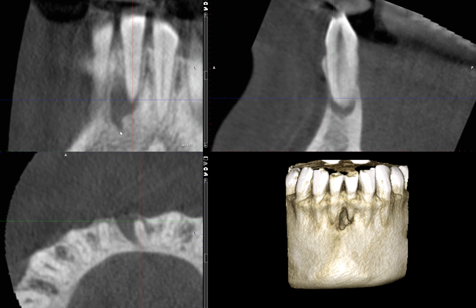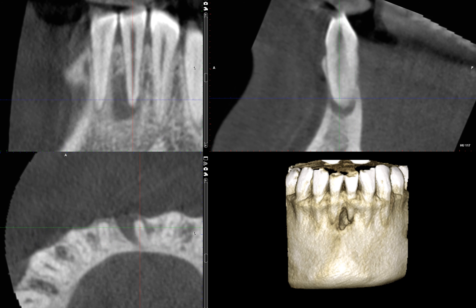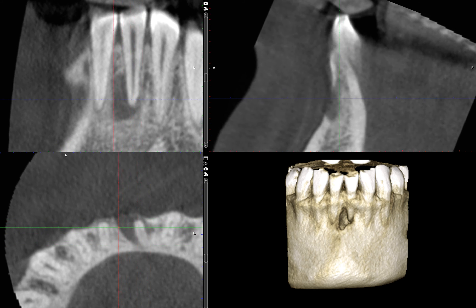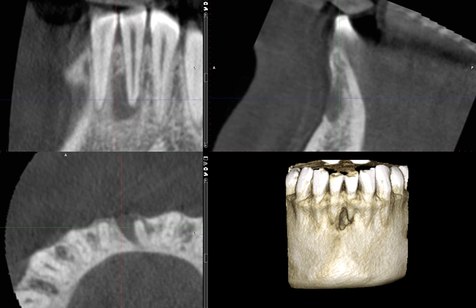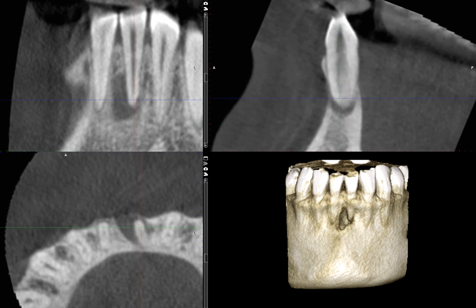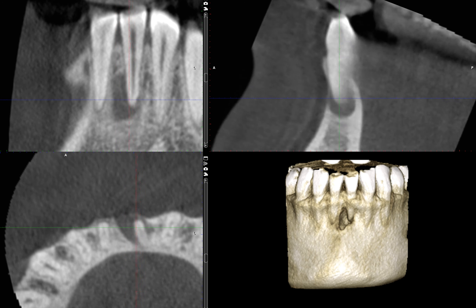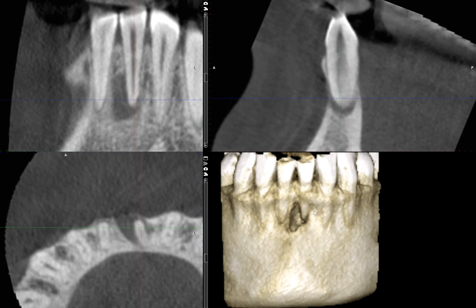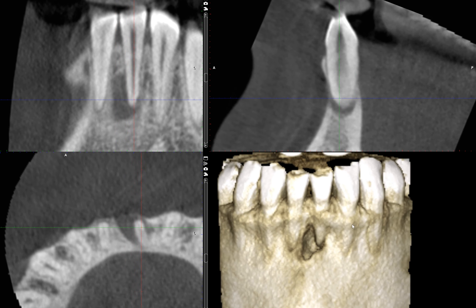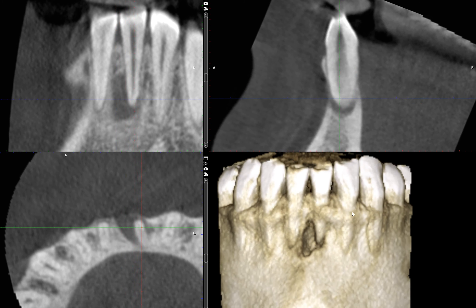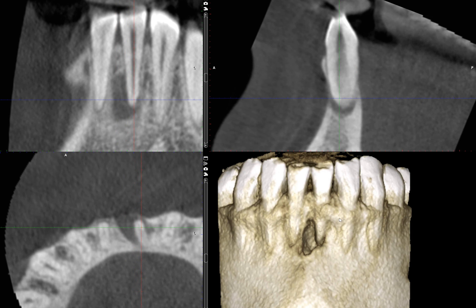Here's the sagittal section showing disruption of the buccal cortex. And here's the 3D rendering. This was imaged today, and the biopsy was also done today, shortly after the CBCT scan. I'll keep you updated once we find out what this is.